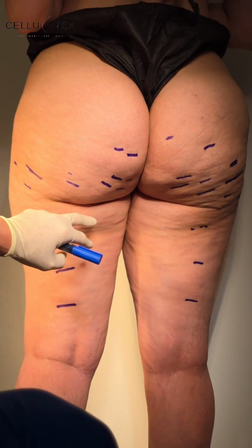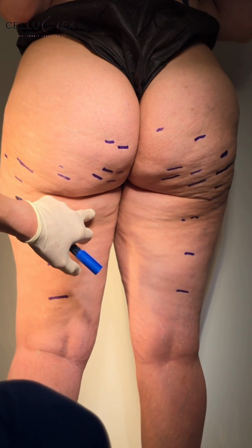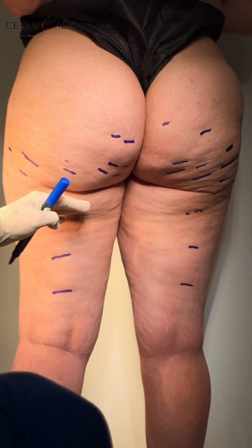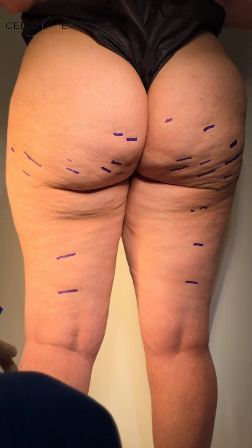This area you cannot go because this is the banana. This is caused by fat bulging. This is not cellulite. If you release it, it wouldn't help much. It might make the banana roll a bit bigger.